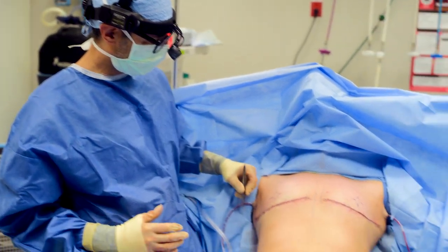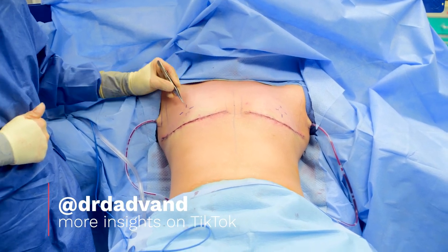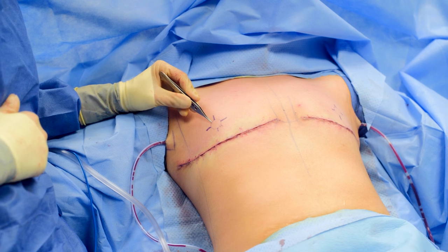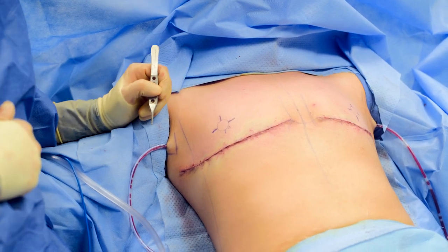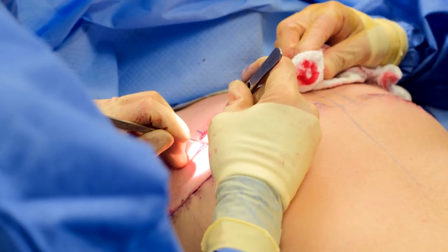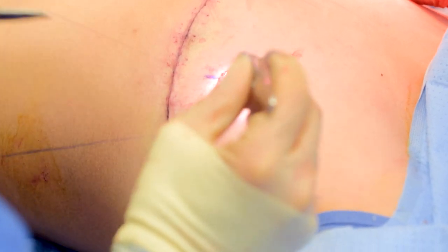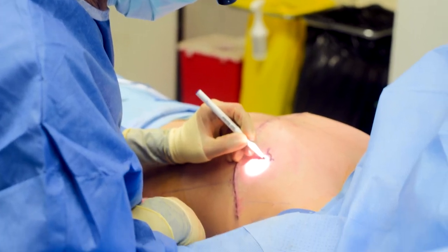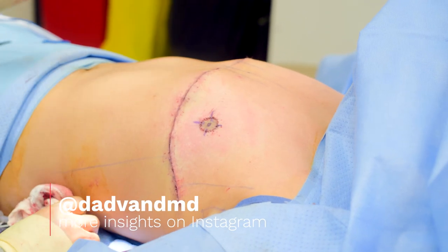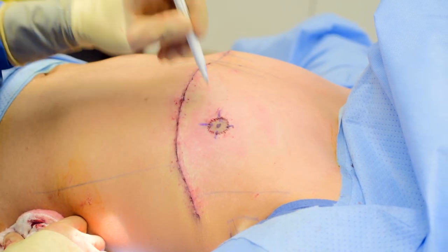I just finished closing the incisions — nice symmetric incisions. These are the markings I made for the new location of the areola. What I have to do is take the very top layer of skin off on either side, then sew in my areola grafts, and then separately sew in the nipple grafts on top. I just finished sewing the areolas on, and I'm just marking where I want the nipple to be. It can go in the middle of the areola. What I'm going to do now is cut away this piece of areola and then sew the nipple down in there.